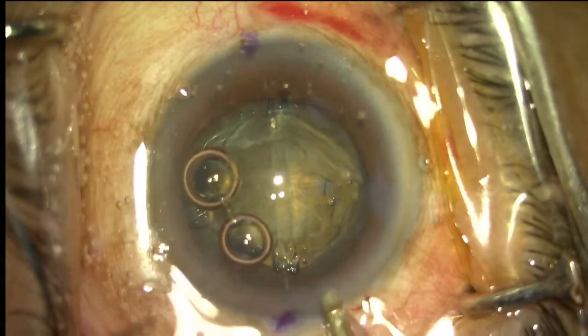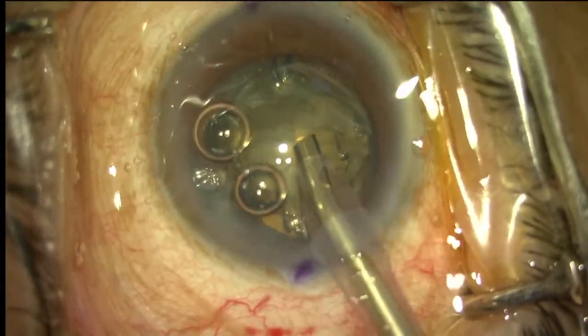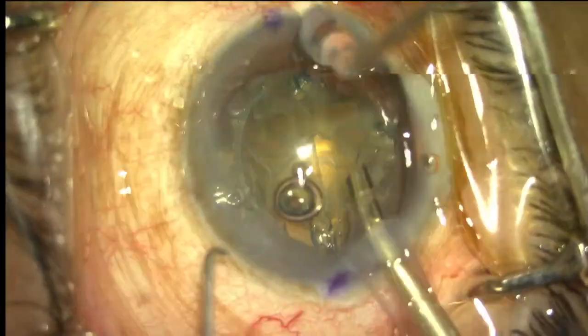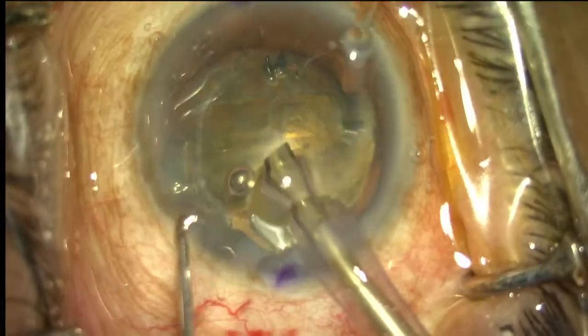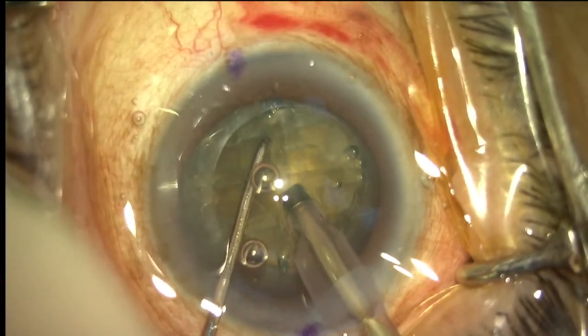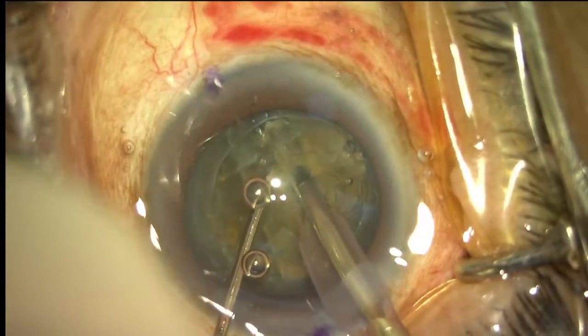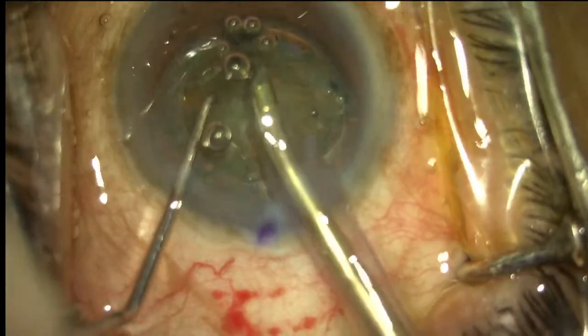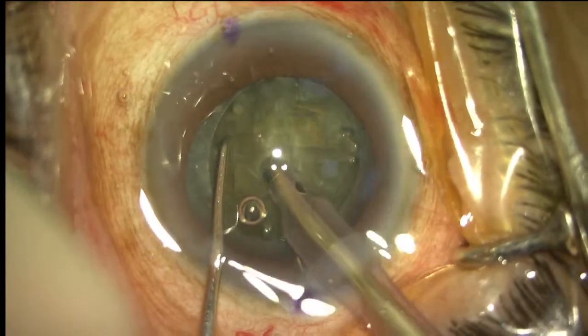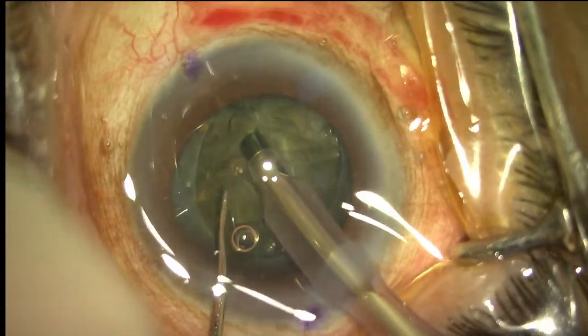This is the Signature Pro that I'm using. You can see that the femto has already been done, so it's so easy to chop it further.